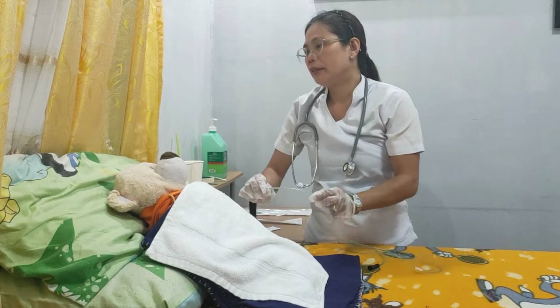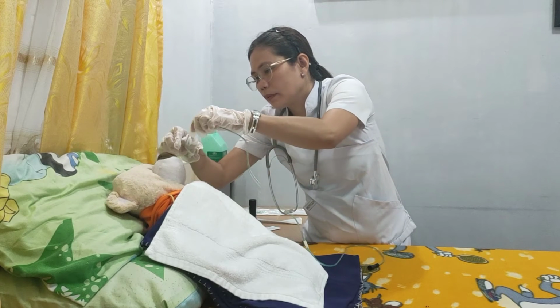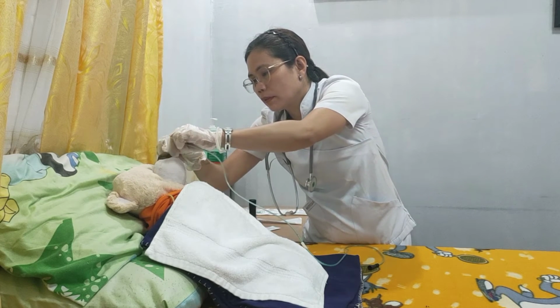Next is to tilt the patient's head back to the pillow and insert the tube until you reach the throat, because normal contour of the nasal passage while inserting the tube reduces irritation and likelihood of mucosal injury. Ma'am, I will just tilt your head back. The client may gag when the tube reaches the pharynx.